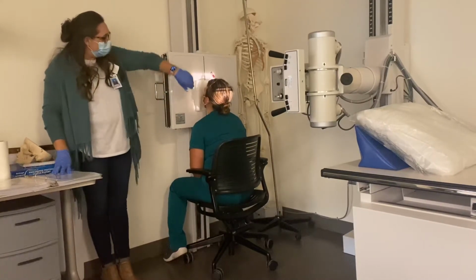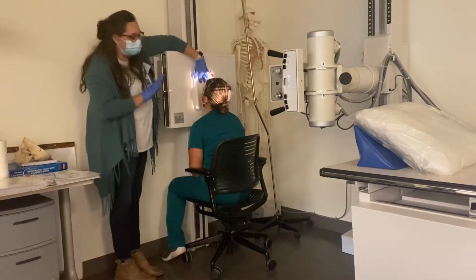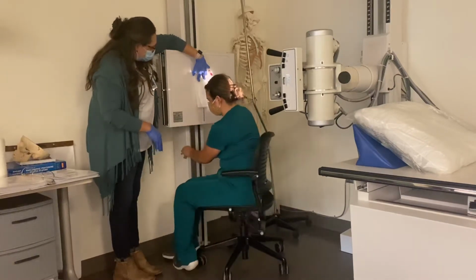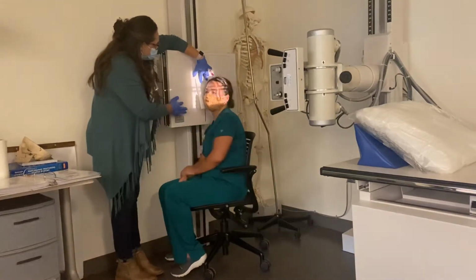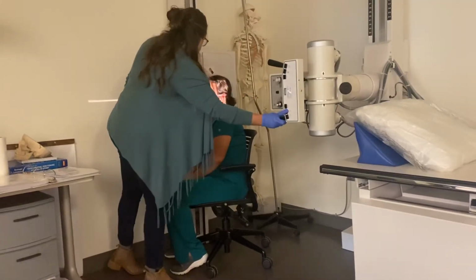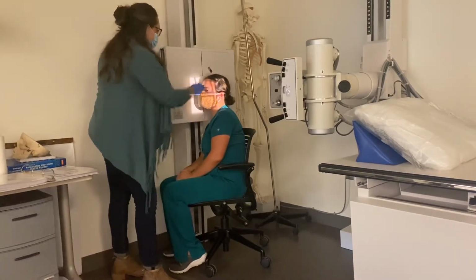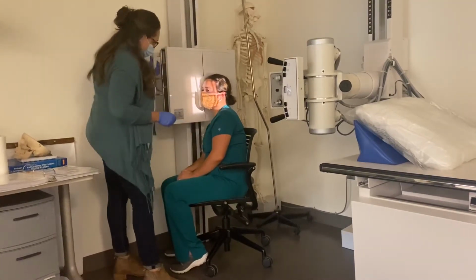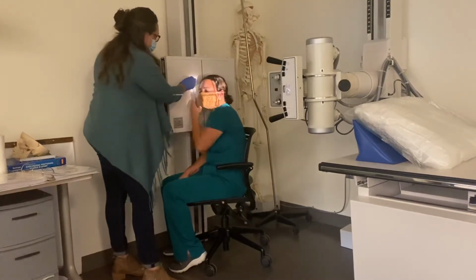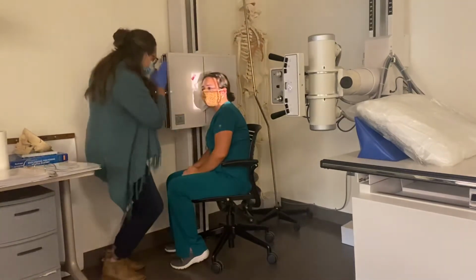After that, we're gonna do the lateral. So we're gonna pretend it's her right side that's affected. I'm gonna have you turn towards me, put your right side up against that board, the right side of your cheek, good. We're centering in the same spot as the facial bones, right on the zygoma, or midway between the outer canthus and the EAM. This board's gonna lower down, don't let me hit your shoulder. I'm gonna put my right marker on the anterior side, and then I'm gonna get right down again.